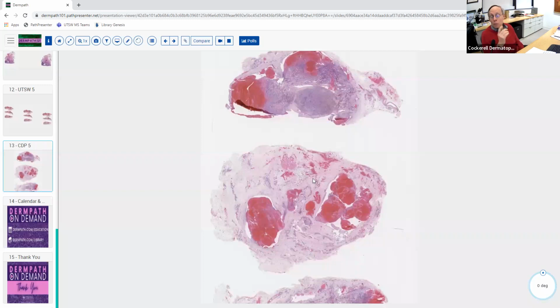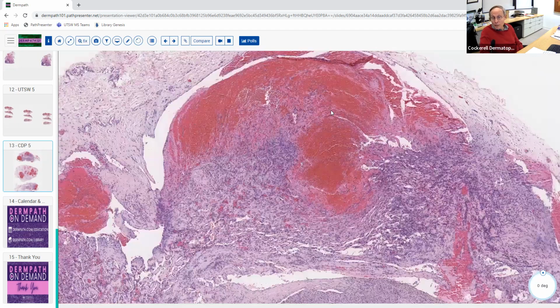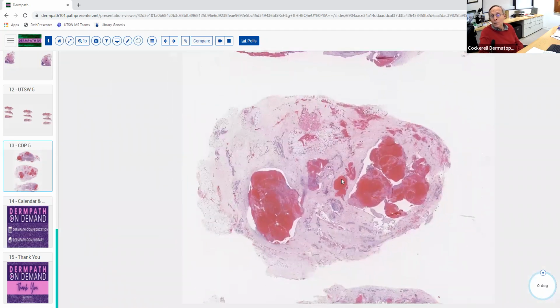Usually these are seen in larger blood vessels. I think of it like somebody maybe gets a blood clot inside a blood vessel, and then it forms a nodule. And then you go in and biopsy it. Well, this is what it's going to look like. It's really granulation tissue sitting inside the blood vessel. It's almost like an organized thrombus is really what it is. So you can see this thing's thrombosed, and probably it was due to trauma. Now you can sometimes see this occurring inside of an angioma, like maybe a large cavernous angioma that gets traumatized and then it clots, and then you get secondary granulation tissue that forms in it, but not generally in an angiokeratoma because those are too small to ever form that sort of granulation tissue-like reaction that we see here.